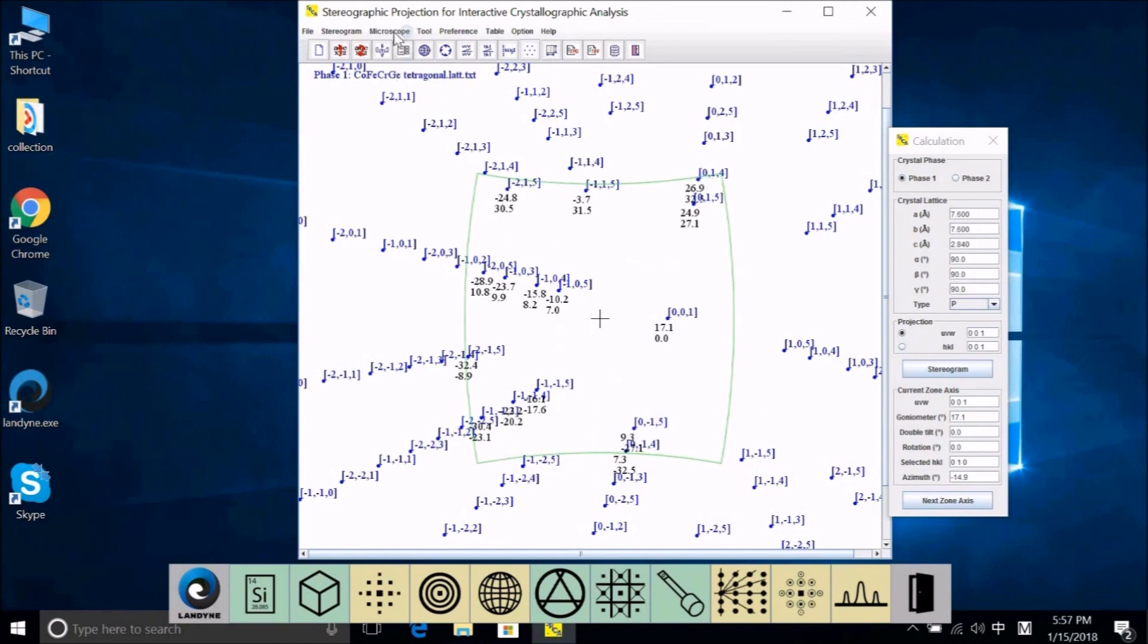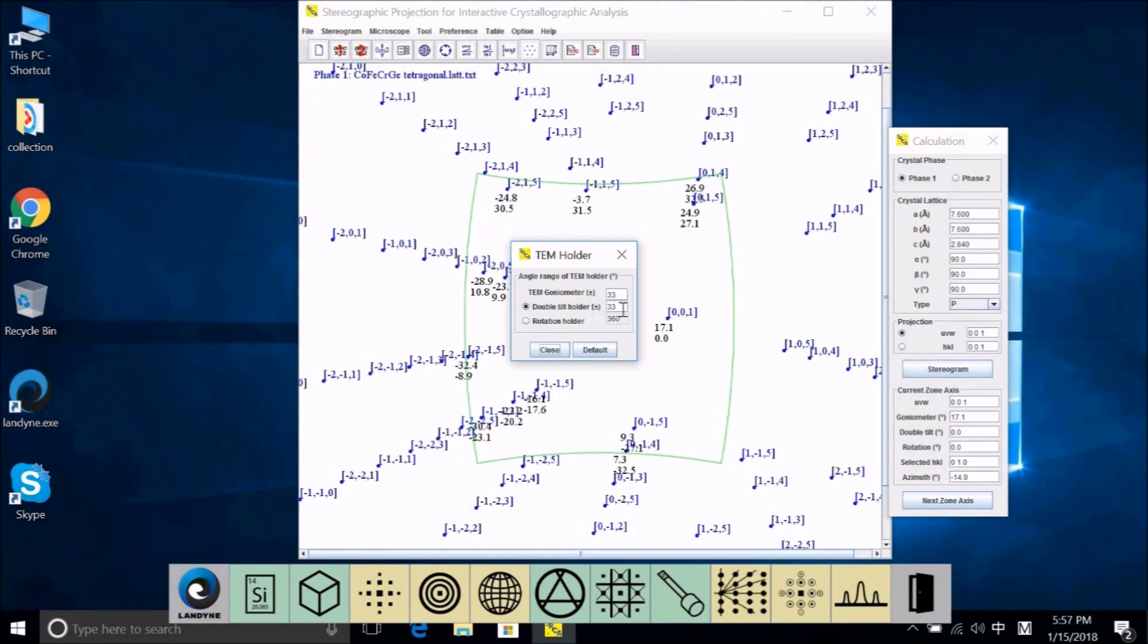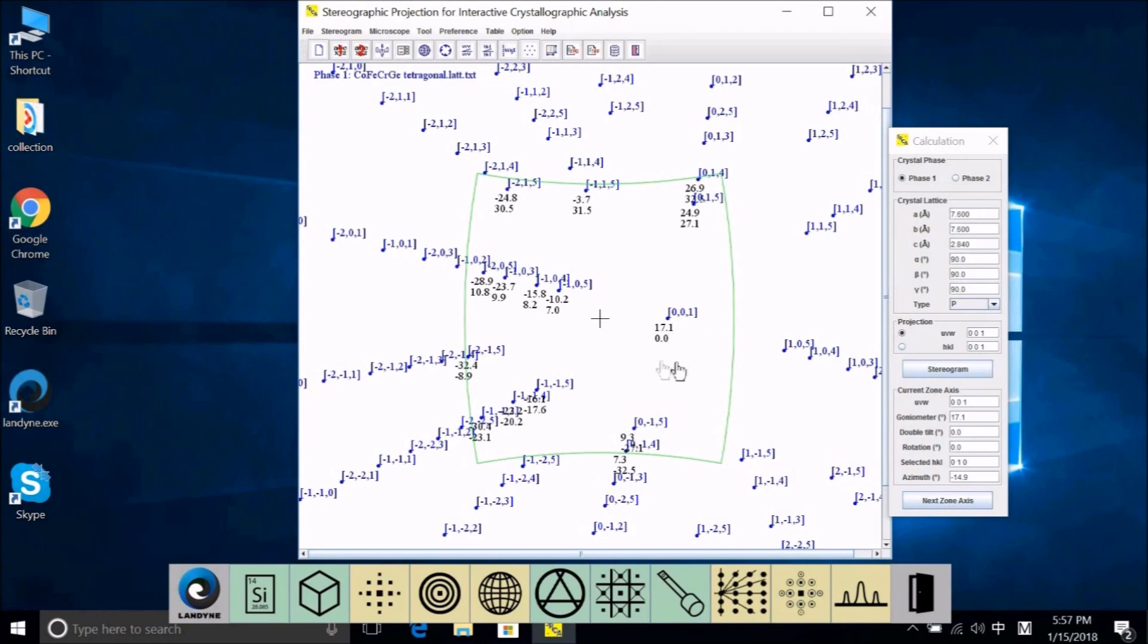The example is cobalt iron chromium germanium tetragonal phase. This example is already described in the paper in Journal of Applied Crystallography 2016. In this case, this is the stereogram. Let me zoom in a little bit and change the font. And now we have 0, 0, 1 in the center. The situation is we know the current zone axis is 0, 0, 1. And the tilting angle for this zone axis on the goniometer is alpha 16.1 and beta tilt is 0.